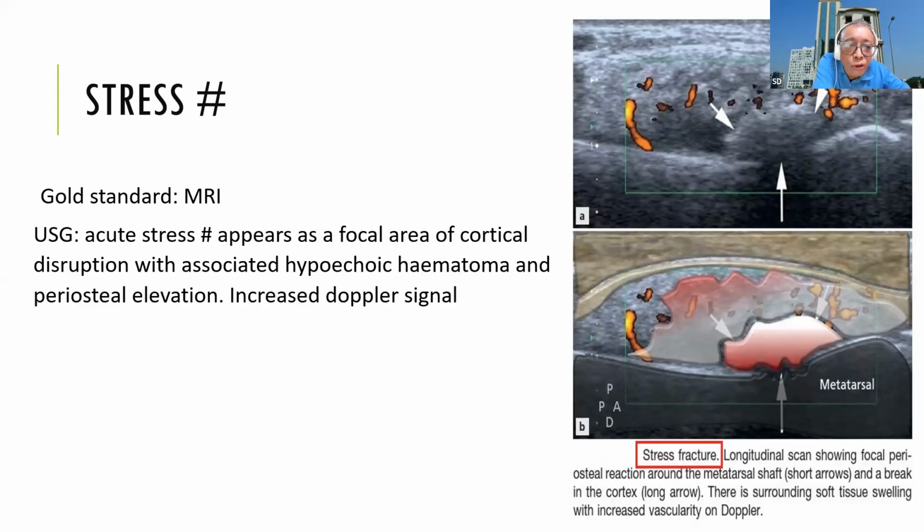We are not basically treating the fracture. So for the diagnostic purpose only, this can be used, and it is very helpful. Without any radiological investigation itself, we can diagnose fracture and refer the patient to our orthopedic counterpart for the further management of the fracture.